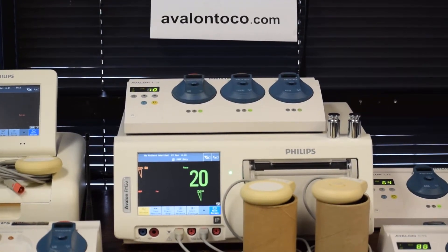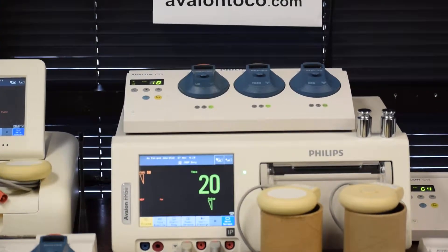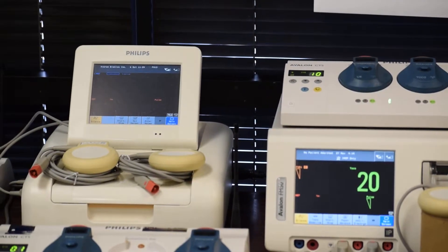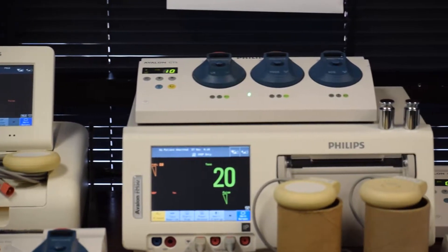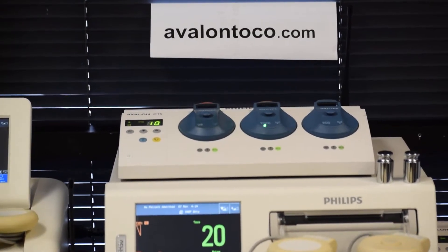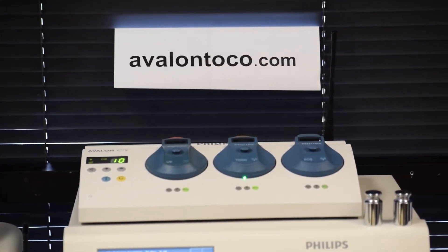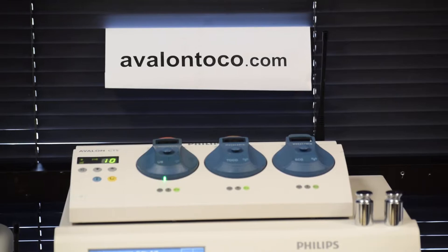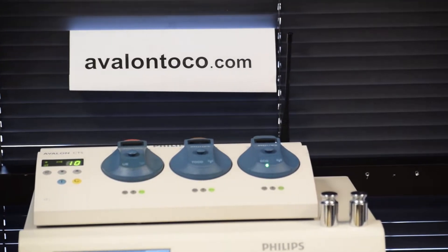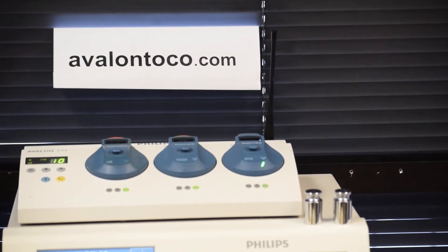What you see here is the Philips Avalon Fetal Monitor model FM50. On the left side is the FM30 model. On top is the Avalon CTS base station model M2720A with three wireless transducers. The middle one is M2725B2 wireless toco transducers. The left side is M2726A with a red tab — ultrasound transducers. And on the right is wireless ECG M2727A.